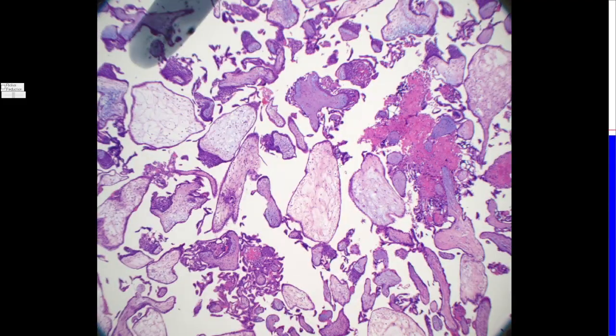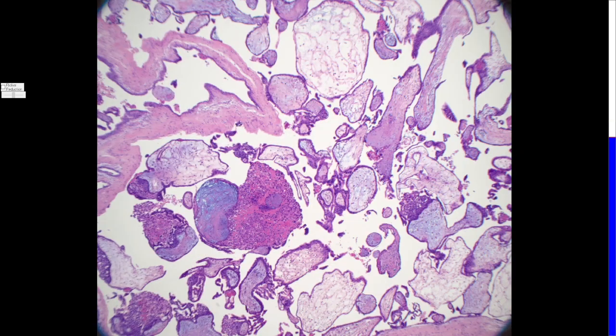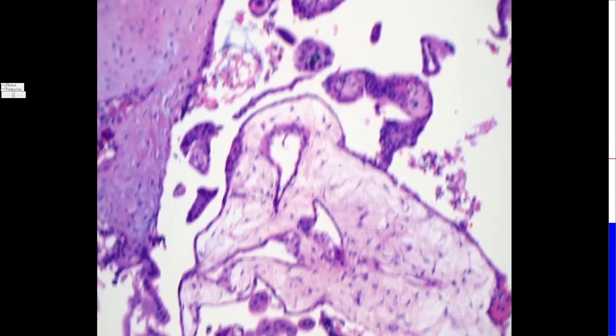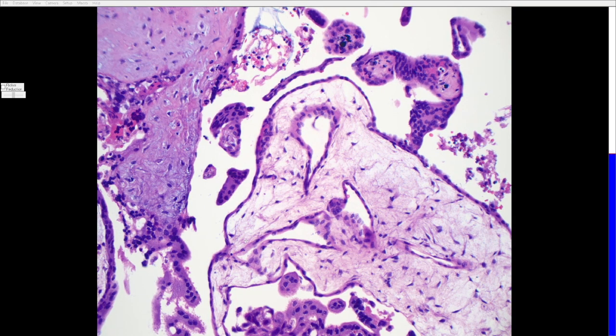So let me see if I can find maybe more trophoblast inclusions or pseudo inclusions. I don't see many. They're usually focal, but that's something you can definitely look for. Here is one. You can look for, so that in the center, probably trophoblast pseudo inclusions right here due to the irregular villus outlines.